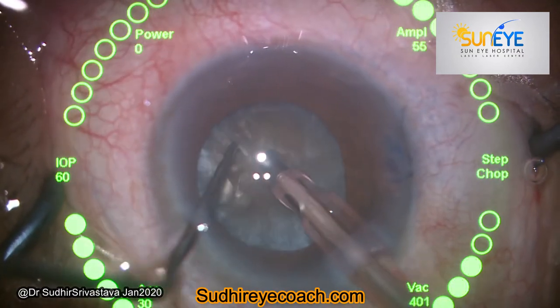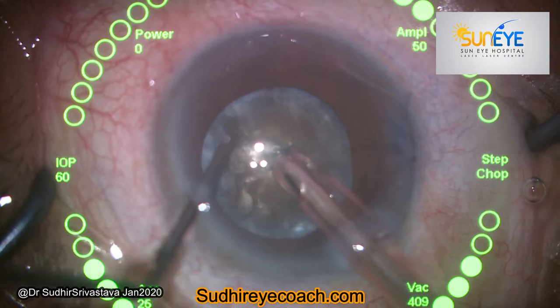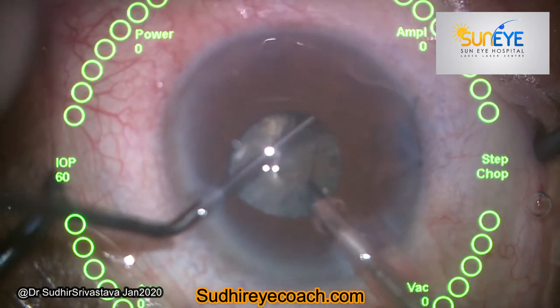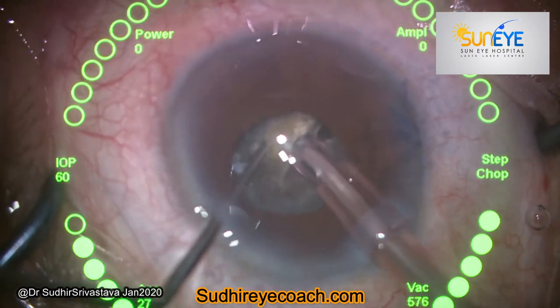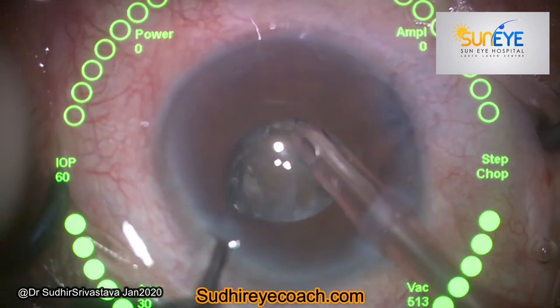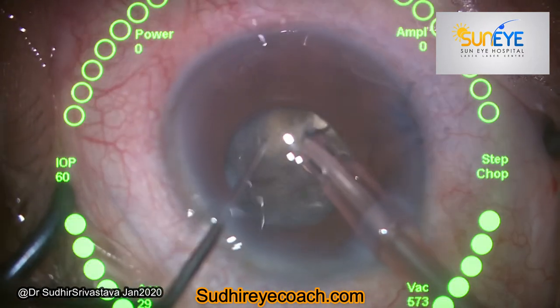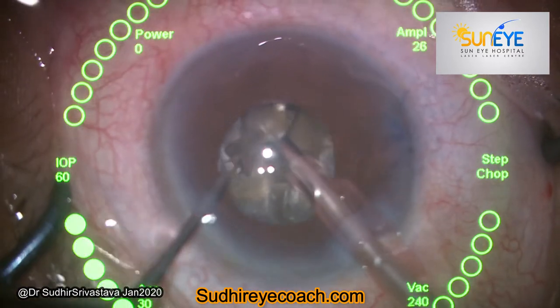In this case, I completed my rhexis and as I started faco fragmentation you can see the movements of the iris. The nucleus was grade 4 plus and I started with the vertical chopping technique. You can see that the pupil has constricted.